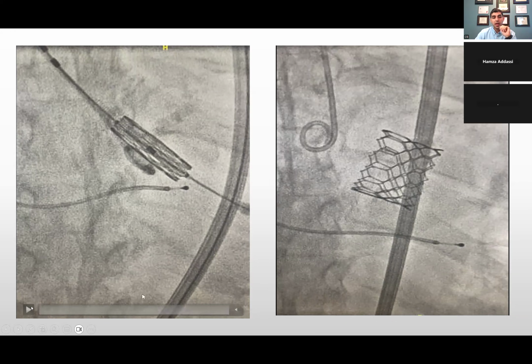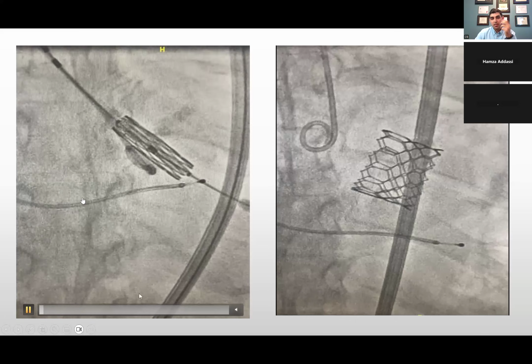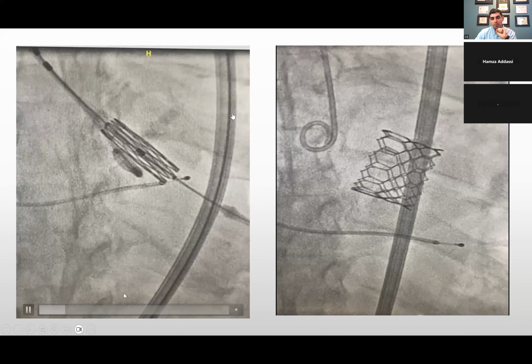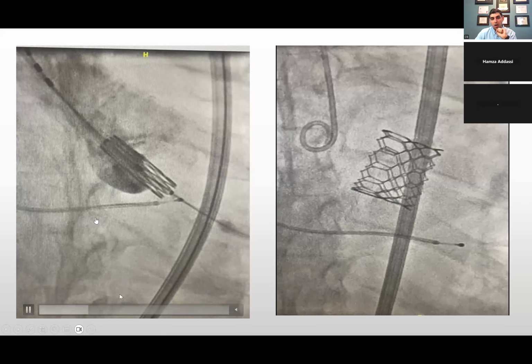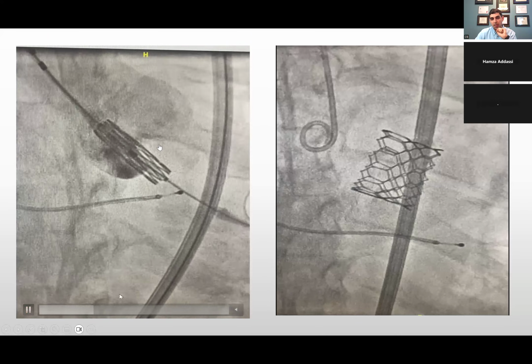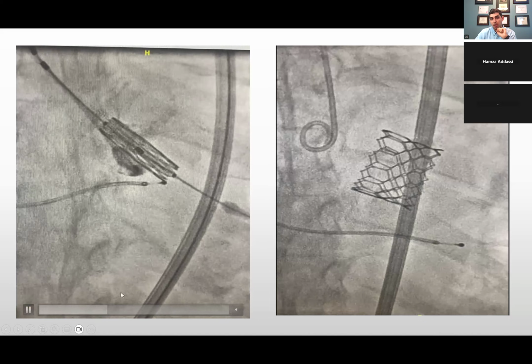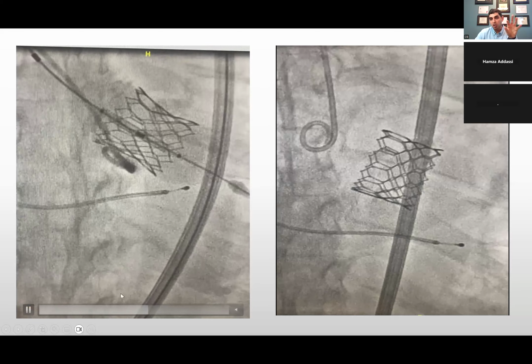And so you can't, for the untrained eye, you probably can't see it, but this is how we look at it, gray and white. And then right here is the heart. And right now, the heart is quivering. You can't really see it, but if you look at this border, the heart is actually quivering. So the pressure dropped.